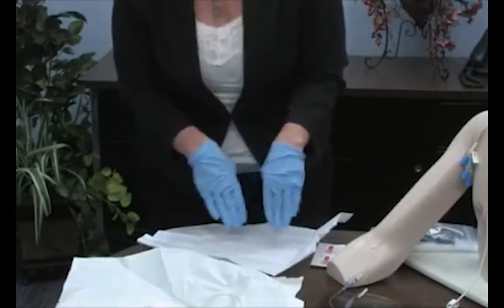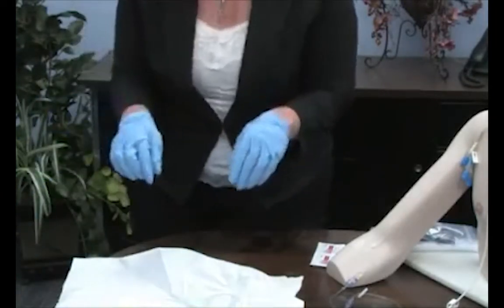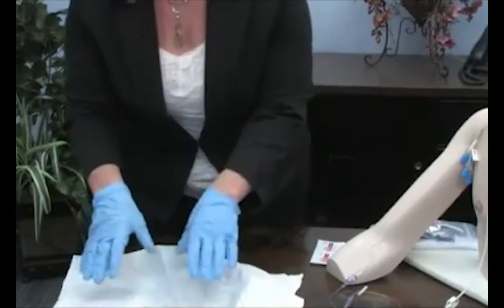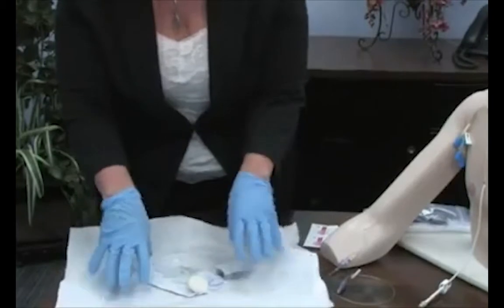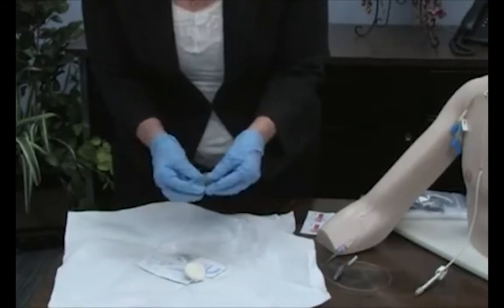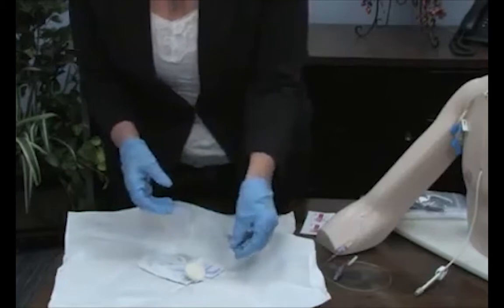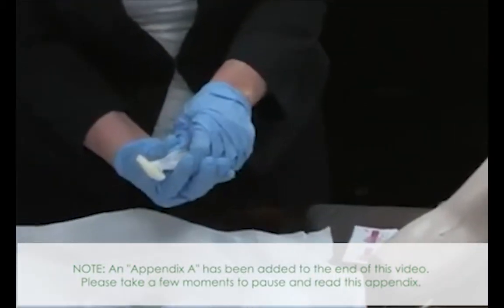The inside of this is still sterile, so I can move it to the side. And of course, I wouldn't want to grab my edges and pull this to me. I can grab this and pull it to me since the inside is sterile. Now, I'm not going to prime this yet. I'm going to wait until my dressing is on, because I can't connect a non-sterile syringe to this while it's in my field. To activate this, you pop this.